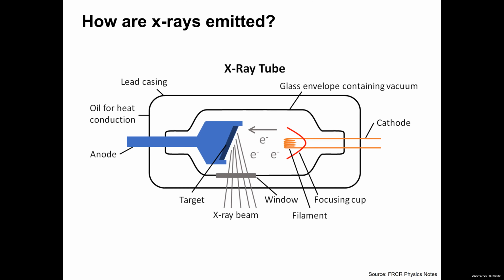The bombardment of the target by the electrons results in conversion of energy to heat and X-ray photons. Heat makes up about 99% of this converted energy, and therefore the anode needs to be cooled, while the remaining 1% is the emitted X-rays, which are then beamed towards the target that the CT is scanning.